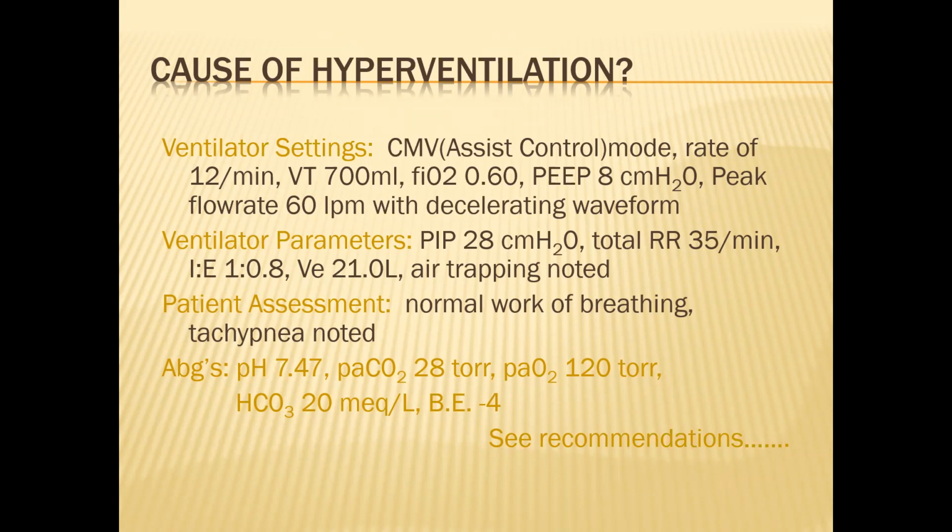Yeah, they'll always breathe over it. So increasing the PRVC rate does not help somebody who's breathing really fast. Nope, not at all. I hope you understand that and you can teach people in the future because it's misunderstood a lot.